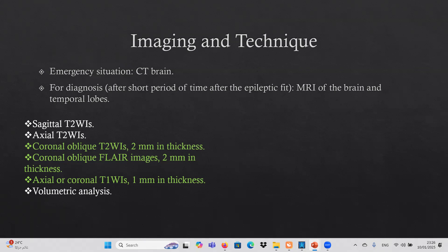We add specific techniques to our routine MRI brain: coronal oblique T2-weighted imaging at 2mm thickness, coronal oblique FLAIR images at 2mm thickness, axial or coronal T1-weighted images at 1mm thickness — very important especially in the pediatric age group for detecting cortical malformations — and volumetric analysis to assess the volume of the temporal lobe.